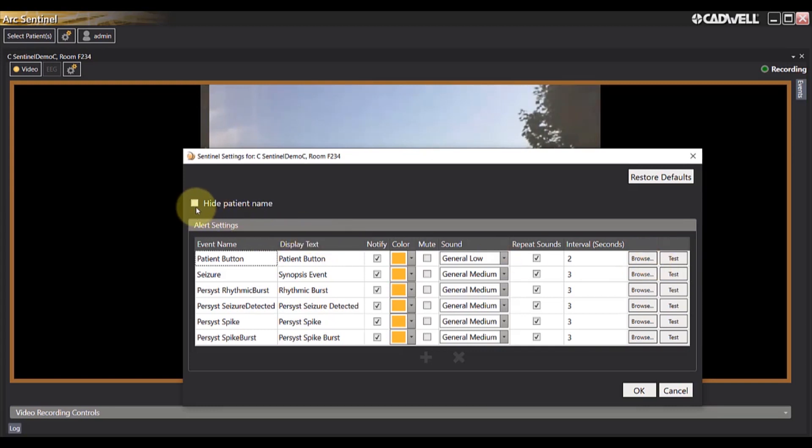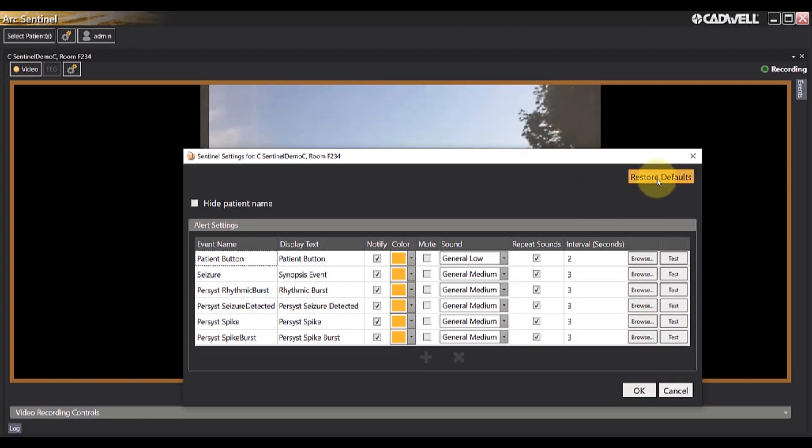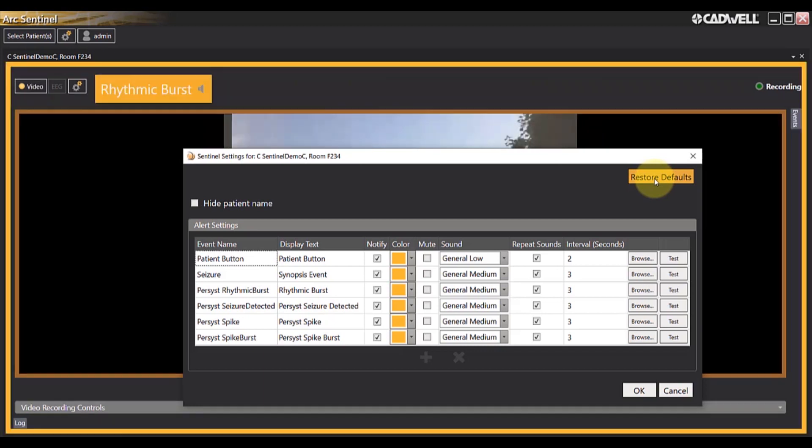You can also choose to hide a patient's name so the patient's name is no longer visible from the Sentinel monitoring screen. At any time, you can restore the factory defaults if the settings chosen are not desired.